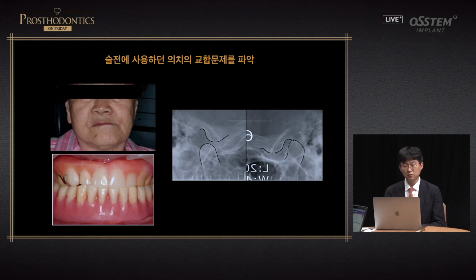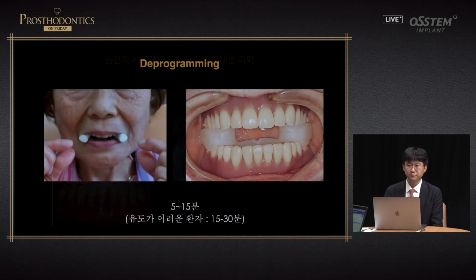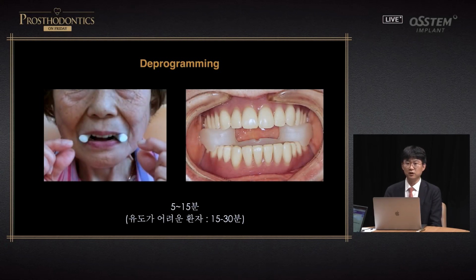muscle for the jaw, the TMJ will be changed. So based on that position, a denture would be fabricated. I will show you a case later. I use this technique a lot even for patients with a dentition to find a stable condyle position.